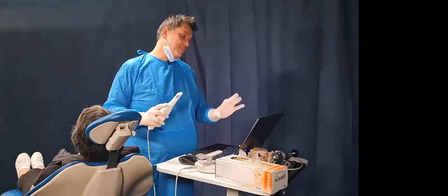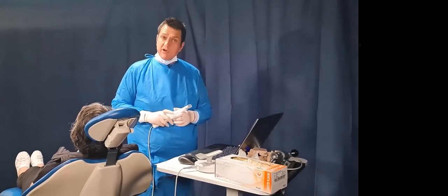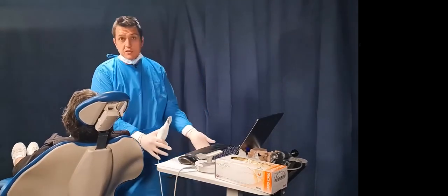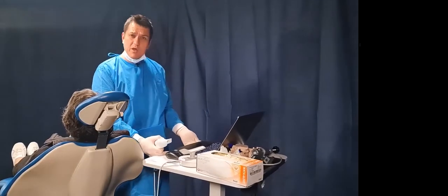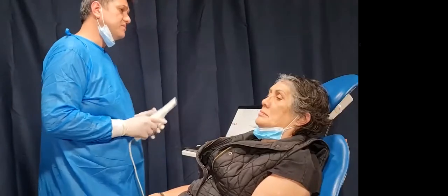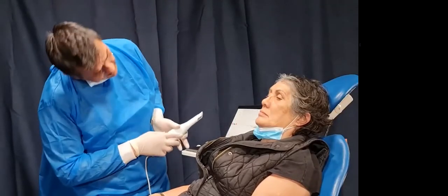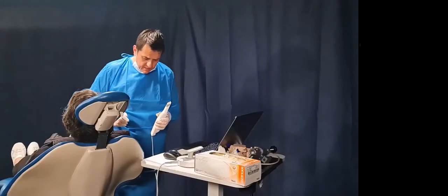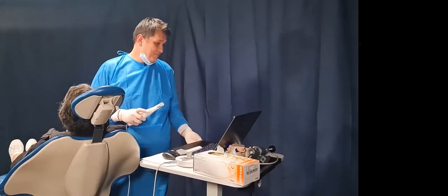So first things first, I've set up the scanner to do the full upper. I'm going to get my patient up a little bit higher, so she's a little bit shorter than our last patient, so we want to get that perfect height, right? We want to get that scanner in the right position, and the patient in the correct position. Now for the full upper again, sometimes you need to get your head under there and have a look, and that's why I like to do the frontward scanning for full upper scans. So let's get into it now.